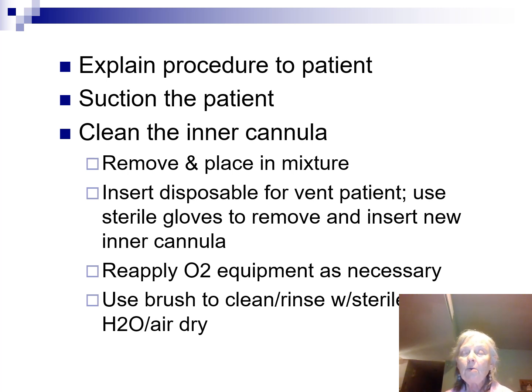Then you can also, in some cases, be able to take that inner cannula out, especially if you're going to throw it away or something along that line. If it's one that you're probably going to reuse, you may want to wait till you put your sterile gloves on. If you have to put a temporary inner cannula in, say you have a patient on a ventilator and they need to go back on the ventilator, then we'll just go ahead and, with our gloves, take the inner cannula out, and then we'll insert a new sterile inner cannula into the outer cannula at that point. You do not touch the body of the inner cannula. You only touch the upper portion of it, okay?